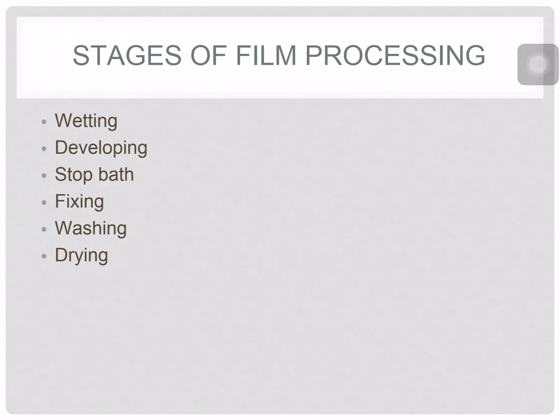Kay automatic processor, this stage is omitted. Bakit? Because the wetting is already included into the developing stage. Okay? So ako, personally wala kaming wetting stage na. Direct ko na siyang inilalagay sa developer solution kapag nagpa-process. Usually, that is the most common practice na nowadays sa may mga manual processor.